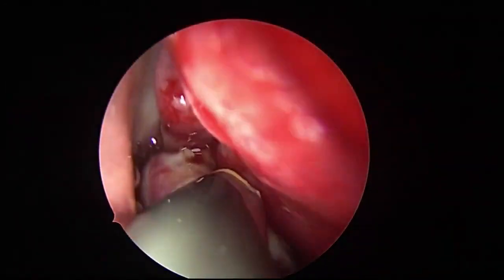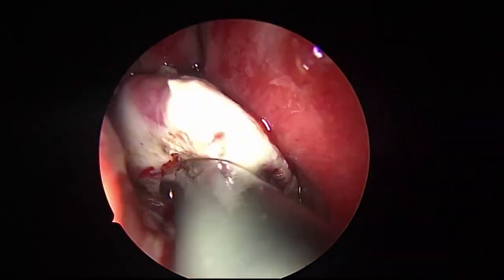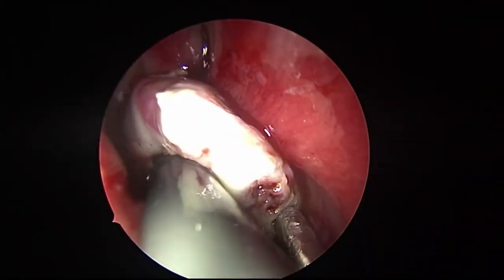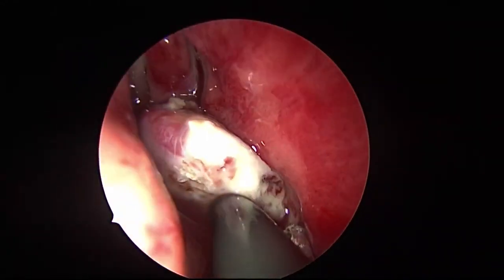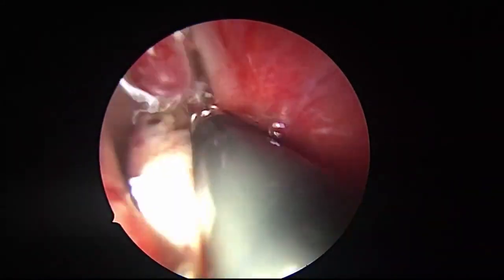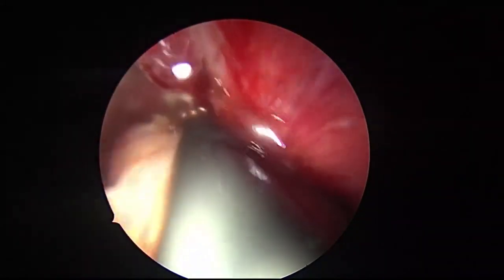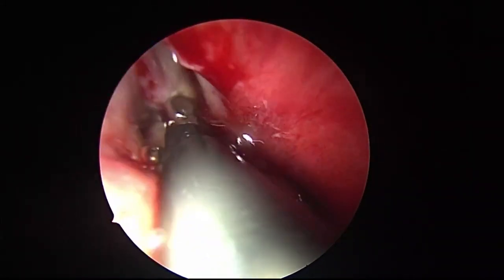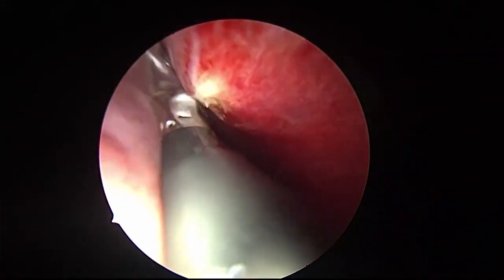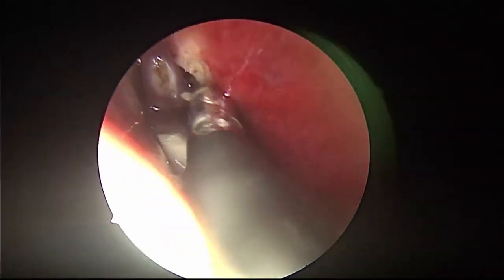Sir, will the tumor get attached to the inferior and middle turbinate at this region? Yes, it is commonly attached to the turbinates, particularly the middle turbinate, not the inferior one. And here also, this is attached to the middle turbinate. We always resect the part of the middle turbinate wherever it is attached. It is commonly attached to the nasal septum, rarely to the nasal floor or the sinus mucosa. These are tumor characteristics.